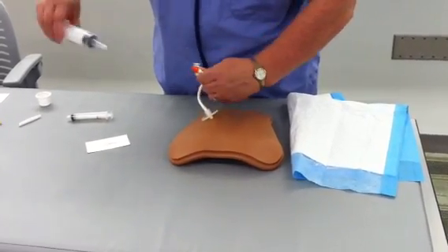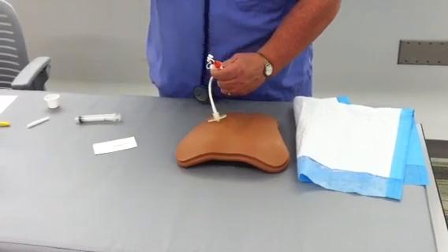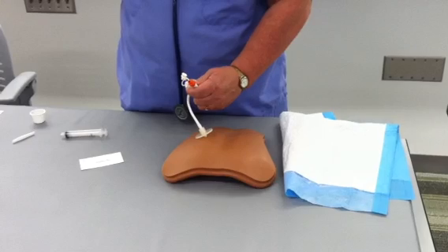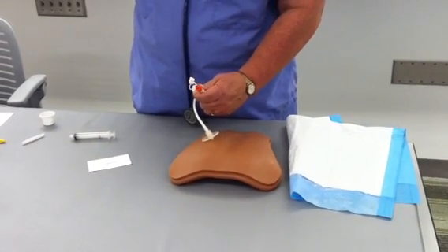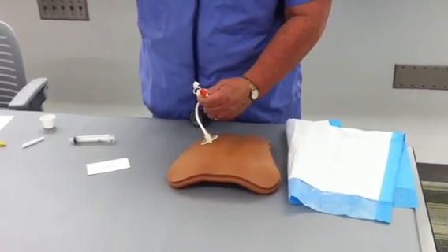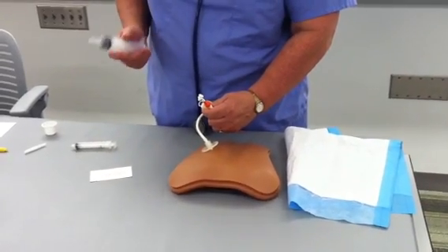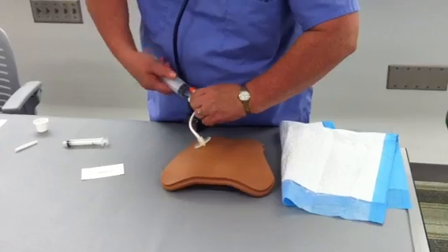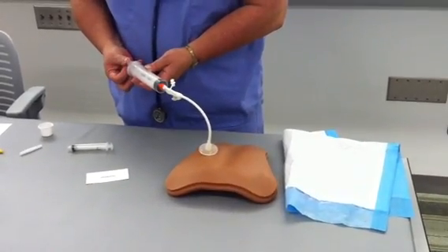The pH should be under 4 unless the patient is on an antacid type pill like a proton pump inhibitor or an H2 blocker like Pepcid, Zantac, Prevacid, all of those. What's the purple pill? The Nexium. So I'm going to check, and the pH is less than 4, so I'm okay. Then I'm going to hook the syringe back up, and I'm going to check for residual.